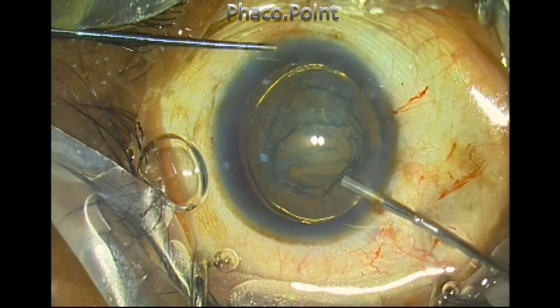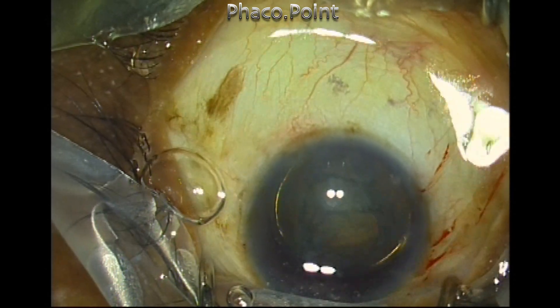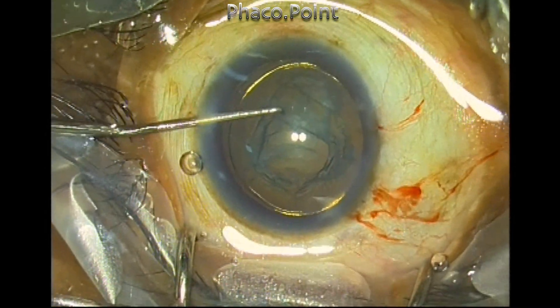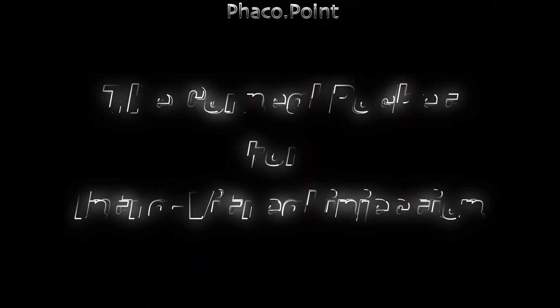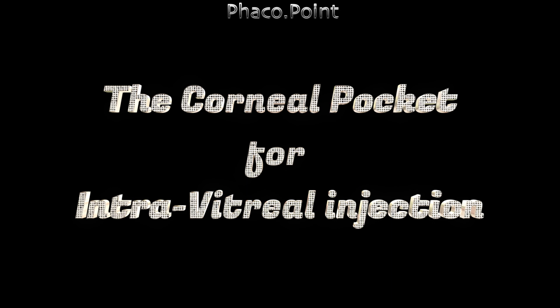The minute I let go of the eye, you can see that it springs back as the prominent Bell's phenomenon kicks in. Once you are able to get both the side port instrument as well as the phaco probe inside the eye, these two instruments are enough to keep the eyeball in the straight-ahead position and the pocket incision is no longer needed.